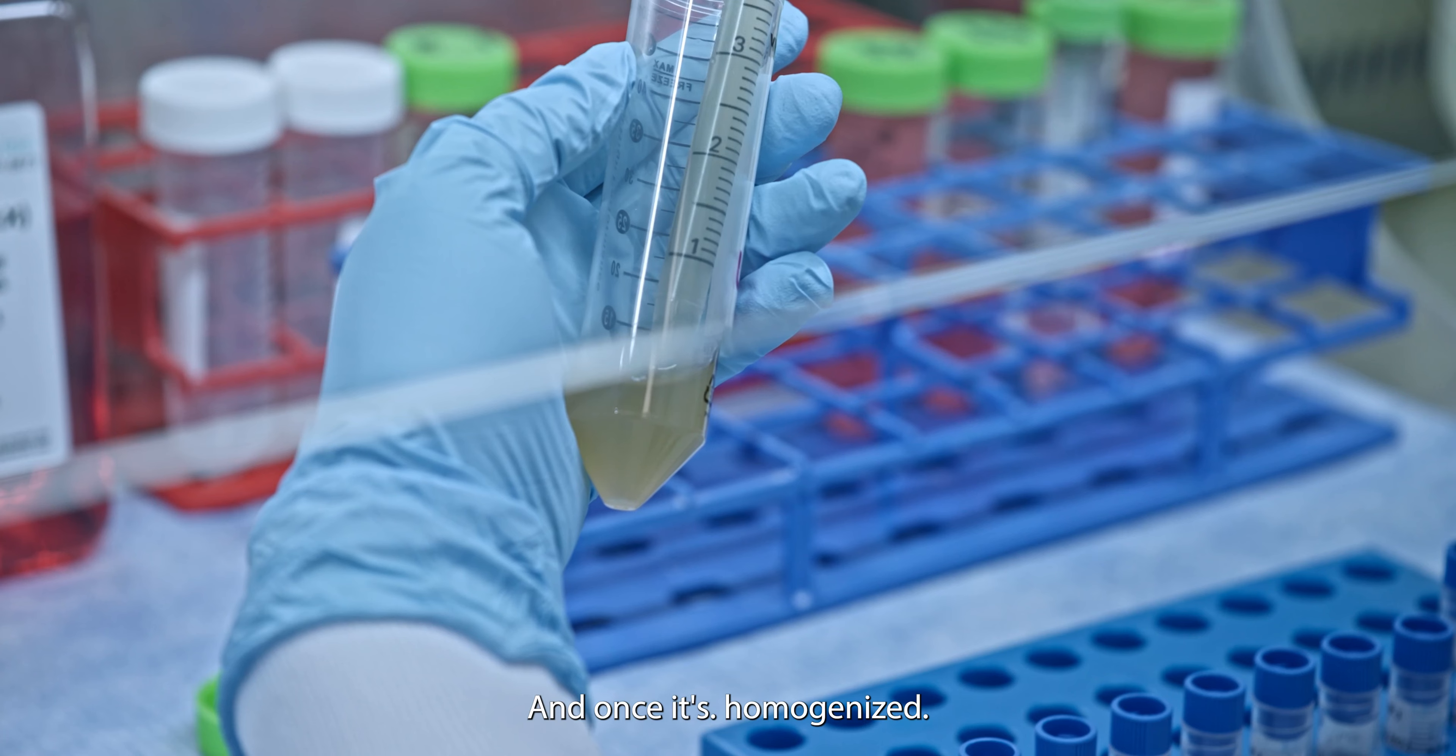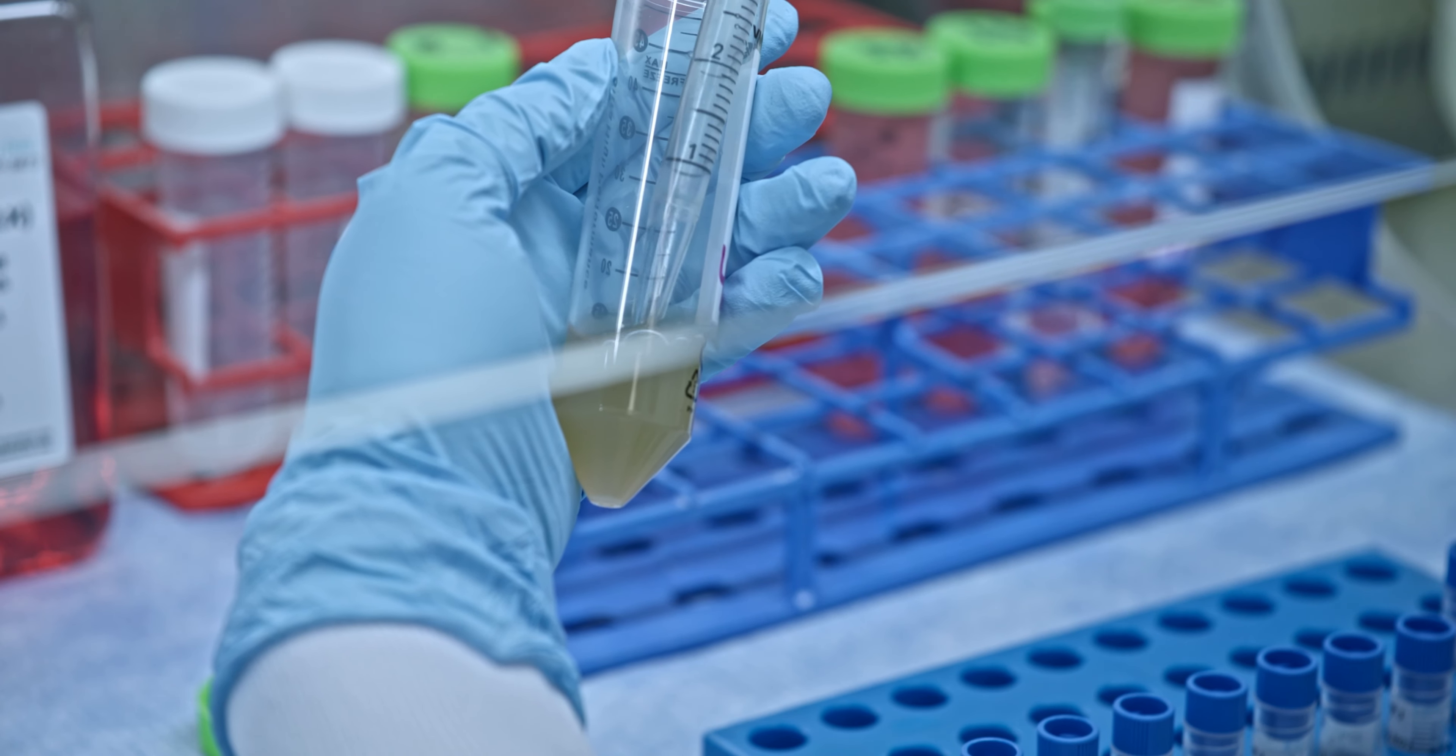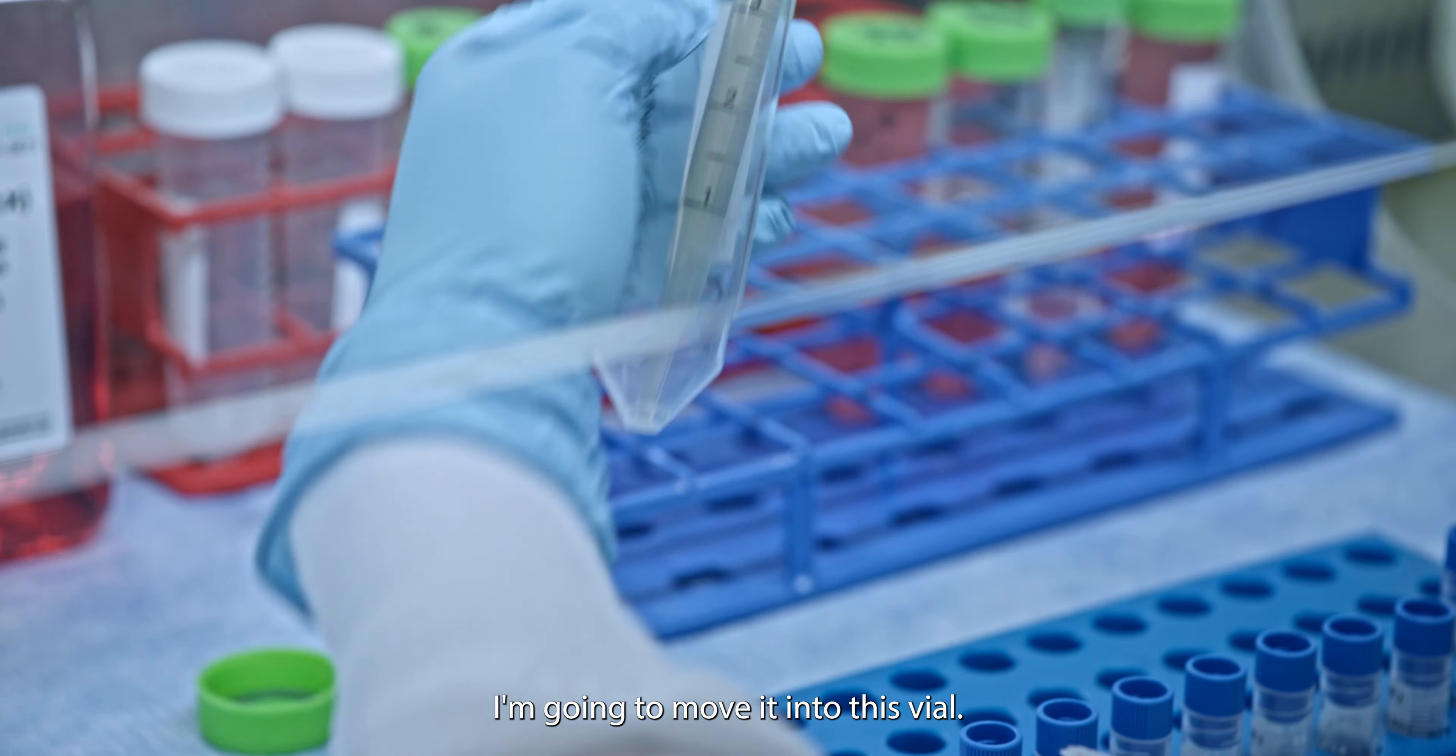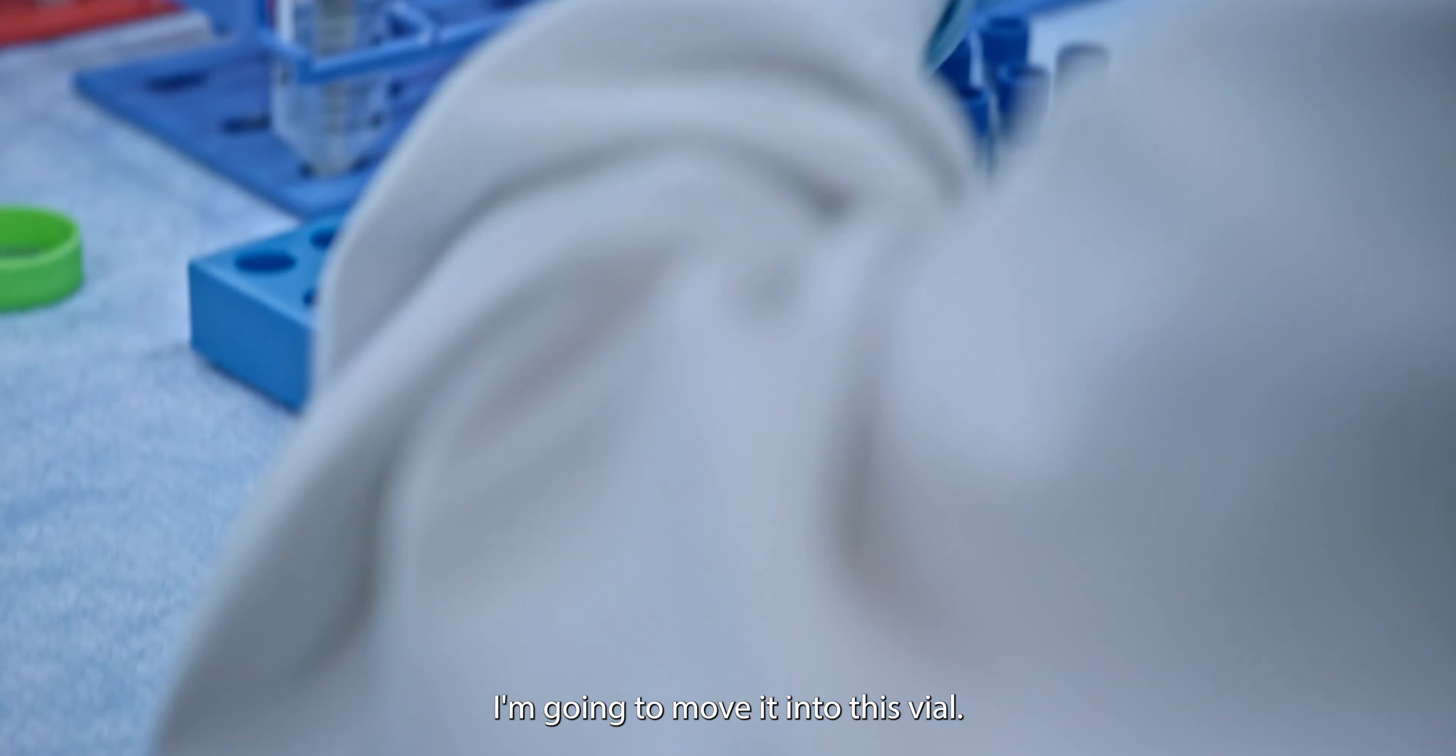And once it's homogenous, I'm going to move it into this vial.